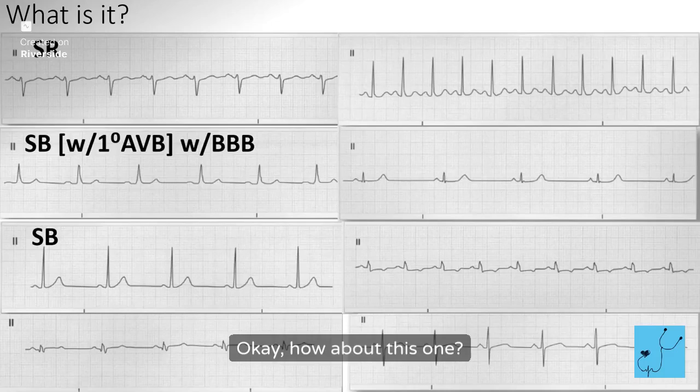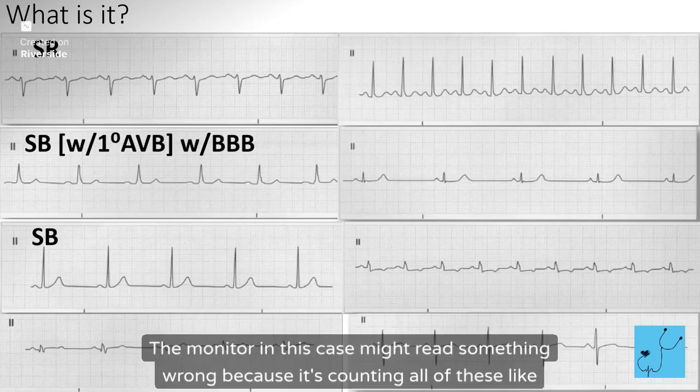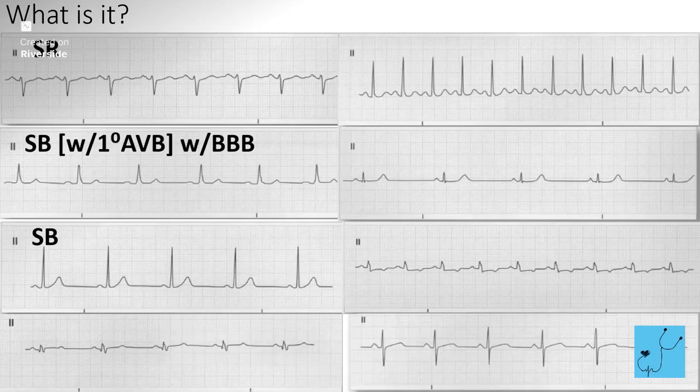Okay, how about this one? We don't like the way it looks. The QRS looks funny, huh? And it's kind of small. The monitor in this case might read something wrong because it's counting all of these the same, because they're all kind of the same height. You might have to go in and change the size of the QRS.